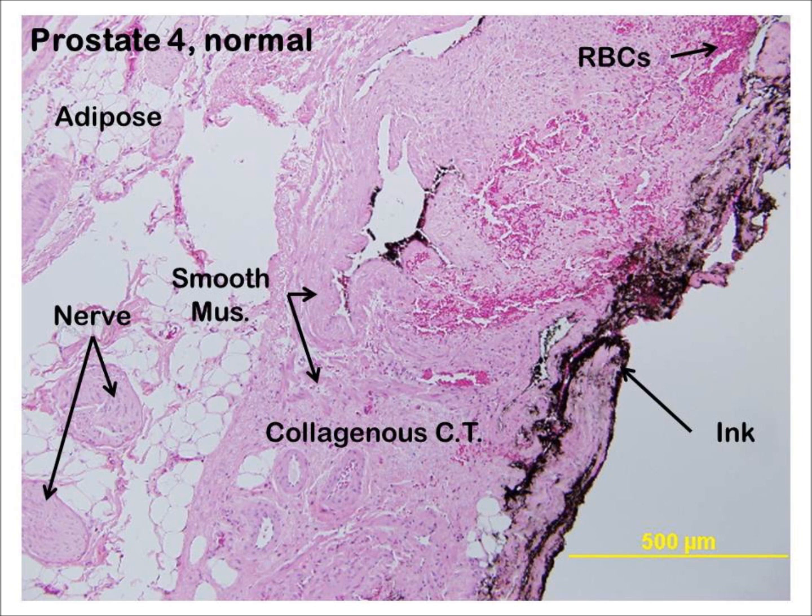Place the slide on the microscope and examine both sections under low power. This figure shows the region near the capsule and contains the ink that indicates the surgical margin. The capsule itself contains a mixture of both smooth muscle and collagenous connective tissue. There appears to have been some bleeding in the section since the connective tissue contains red blood cells, or RBCs, that are eosinophilic staining. Also note the nerve tissue that is encapsulated and has a wavy appearance; the nuclei here belong to the Schwann cells that myelinate the axons.